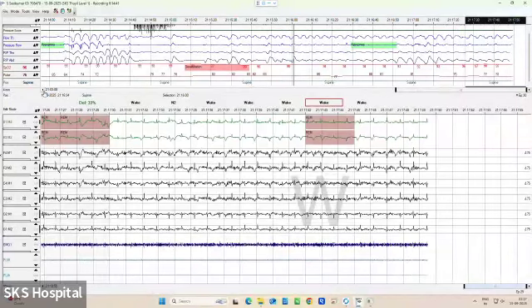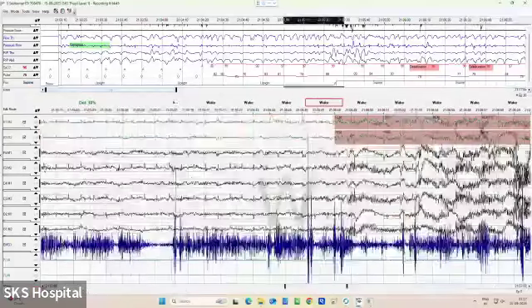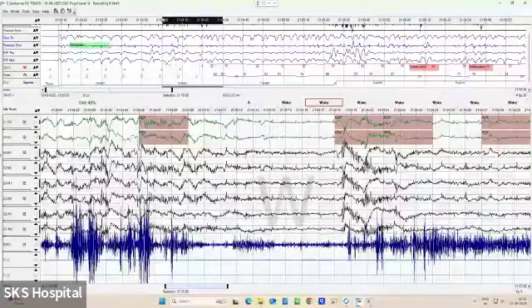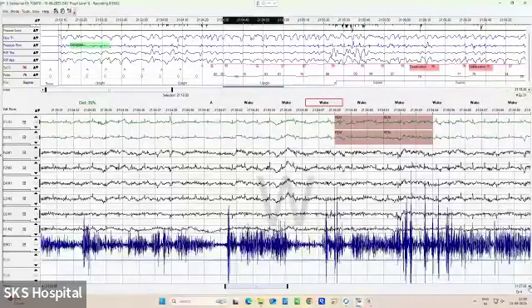Like here, you can see a small box moving, which is the 30 seconds shown here. The 30-second EEG recording that matches up with this respiratory channel is what this box means. When you keep moving it, the box moves to the next epoch. So this 30-second epoch will be depicted by the respiratory channels here. So it's a 4-minute window with the 30-second epoch shown down here.